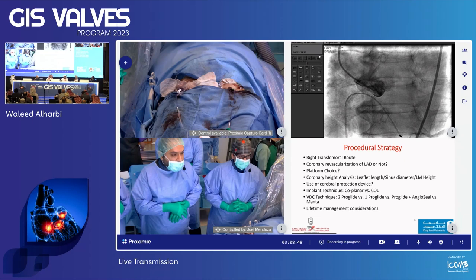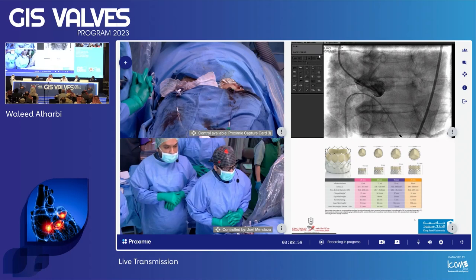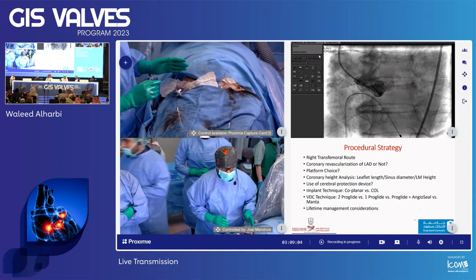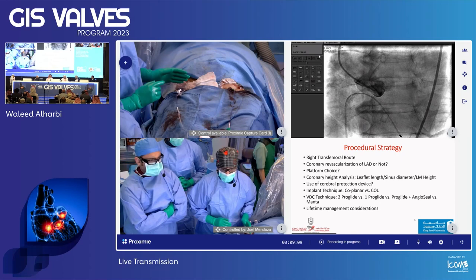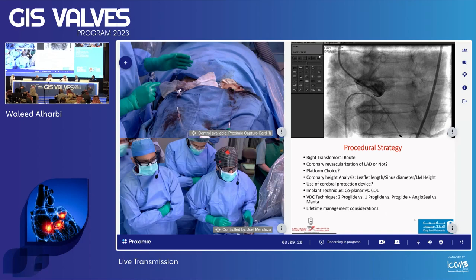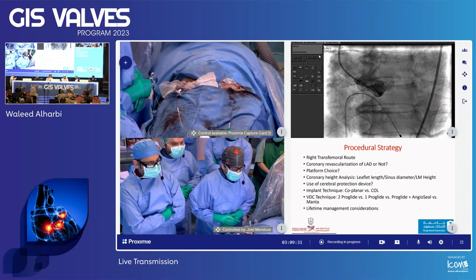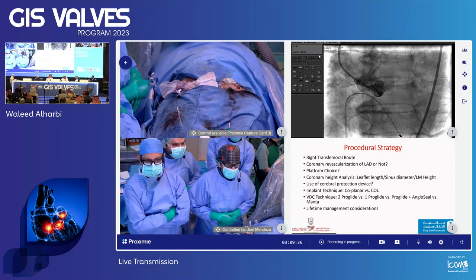Before we start, I'll outline our basic operative plan. We placed the device sheath in the right femoral using ultrasound- and fluoroscopy-guided combined access, ensuring we are above the bifurcation and below the inferior epigastric artery. We went to the left femoral for the pigtail. We usually use radial, but the patient preferred not to, so we accommodated that preference.